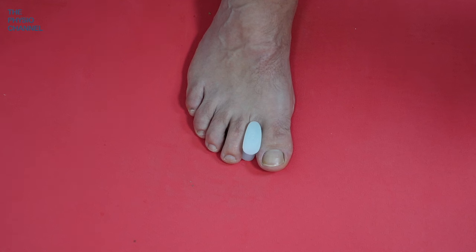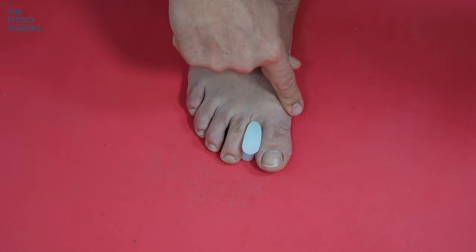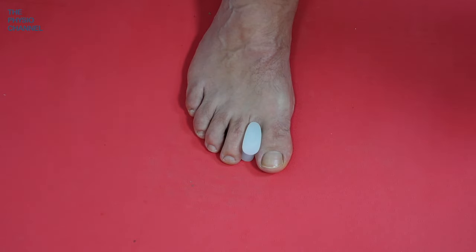The research supports the use of toe spacers and shows that when used by patients suffering from pain relating to hallux valgus or bunions, the simple intervention of adding a toe spacer can help to reduce pain with walking.